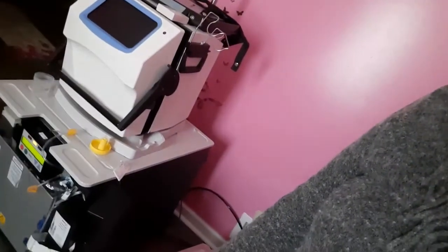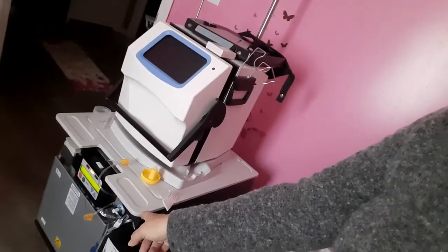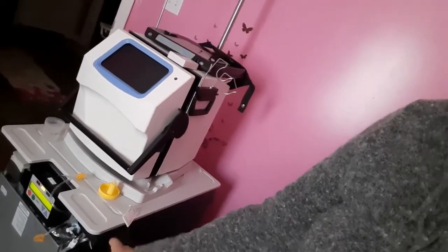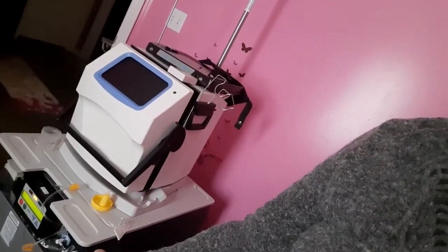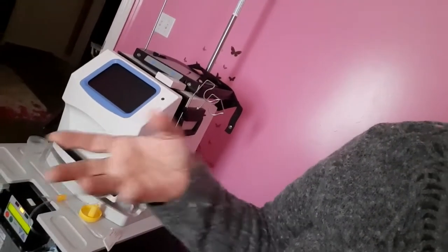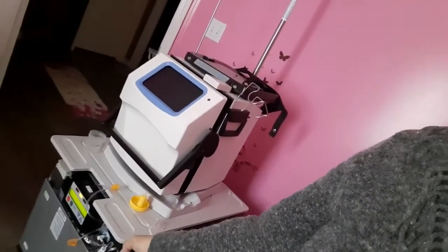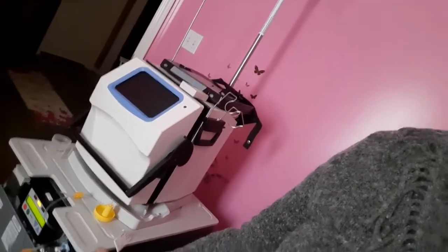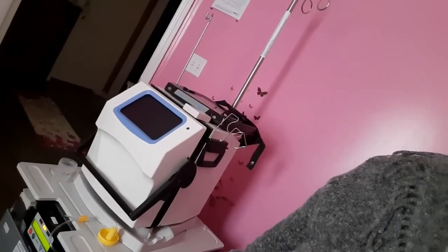And that noise you hear, that's the PureFlow. We connected that yesterday, but for some reason, it keeps alerting to fluid in the tub. So I'm thinking the bag may have a leak, and that's after it primed for 7 hours. I'm thinking as it filled up, that's when the leak surfaced. I'm draining it now because that bag is so heavy once it's filled, you can't lift it. So I'm draining that, and then I'm going to start from scratch.